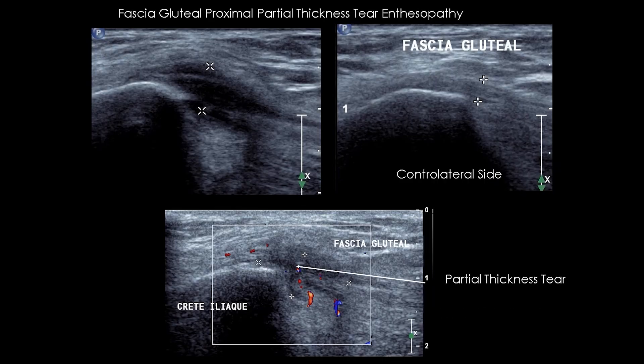Example of proximal enthesopathy with partial tear of the gluteal fascia. The gluteal fascia tendon enthesis has a thickened, hypoechoic, and dedifferentiated appearance with peritendinous Doppler hyperemia, associated with an anechoic intratendinous linear lesion corresponding to a partial tear.